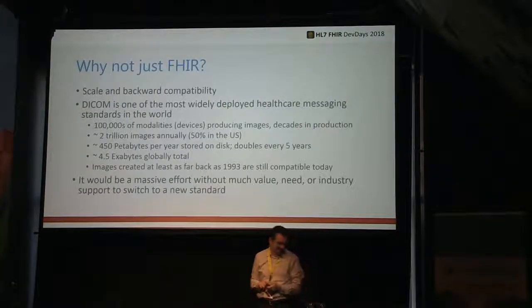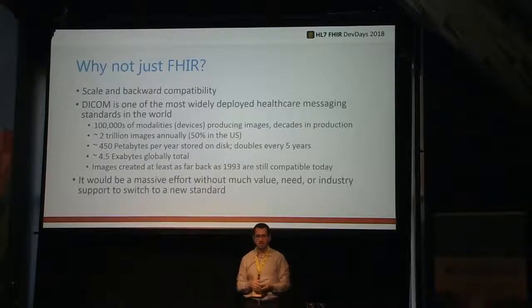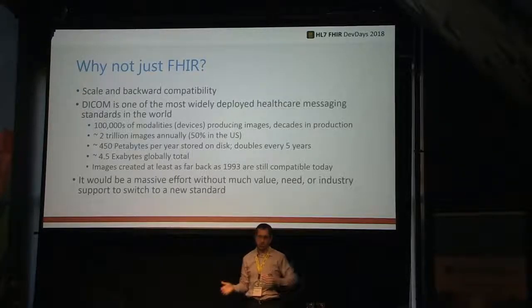All right, so a common question we get, especially in a conference like this where people may not necessarily know about imaging: why can't I just put it in FHIR? Why do we need DICOM? Someone actually even once asked us, when are we going to put DICOM out of its misery? And I agree about the misery part, but the putting out part is a little too extreme. If you read the slides, I'm not going to read them, the reality is DICOM 1 has been there for a very, very long time. You can't just easily retire it.